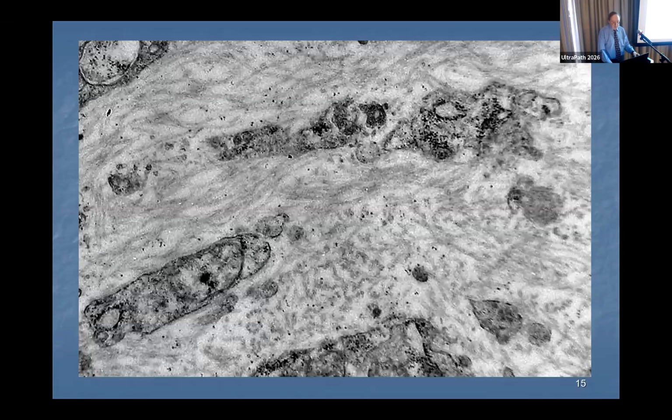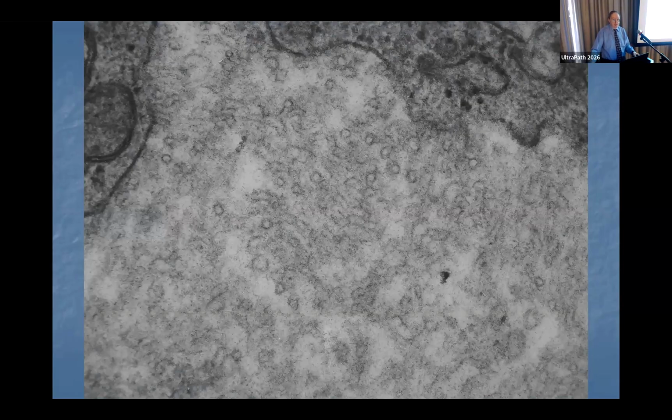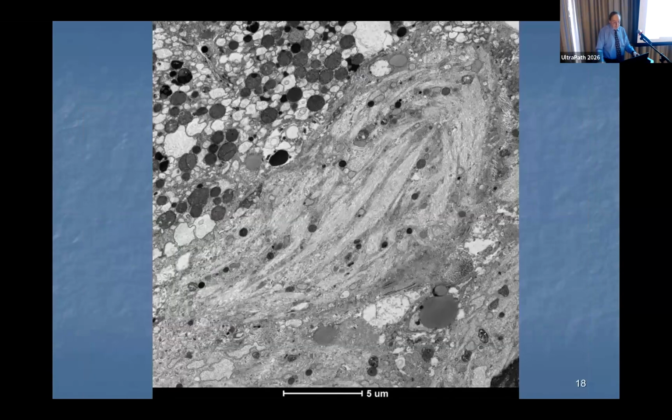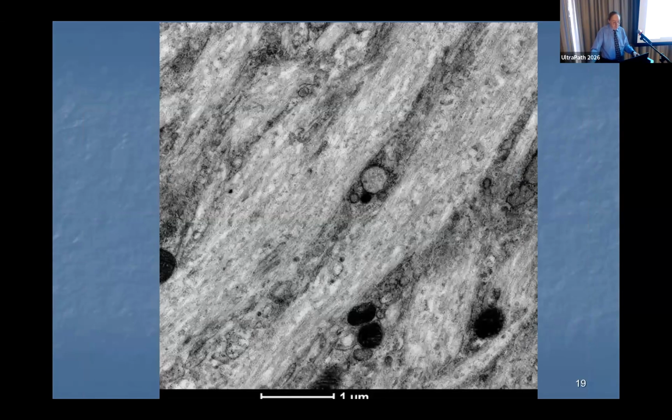These are about 18 to 20 nanometers probably in size. And here you can actually see cross sections which really confirm that this is a tubular structure associated with that. Also, if you look at the liver, we did electron microscopy in the liver, and you can see similar type of structures here as well. So these features are fairly characteristic for a specific storage disease, Gaucher's disease.